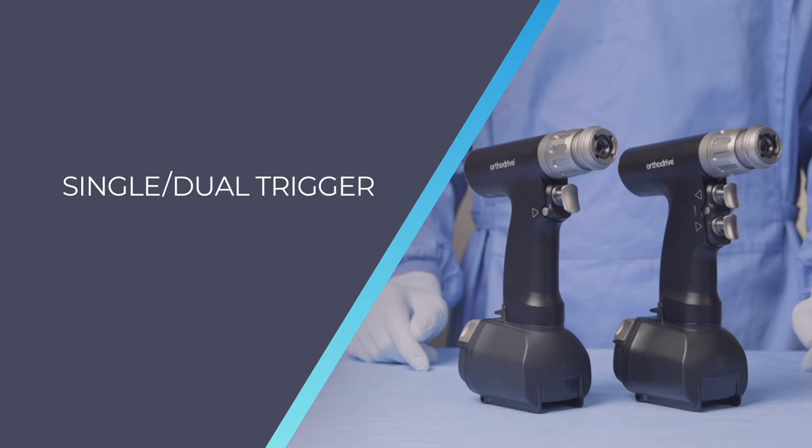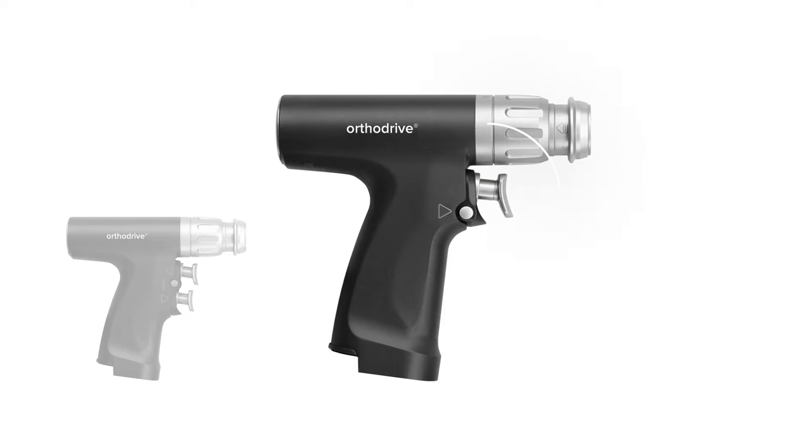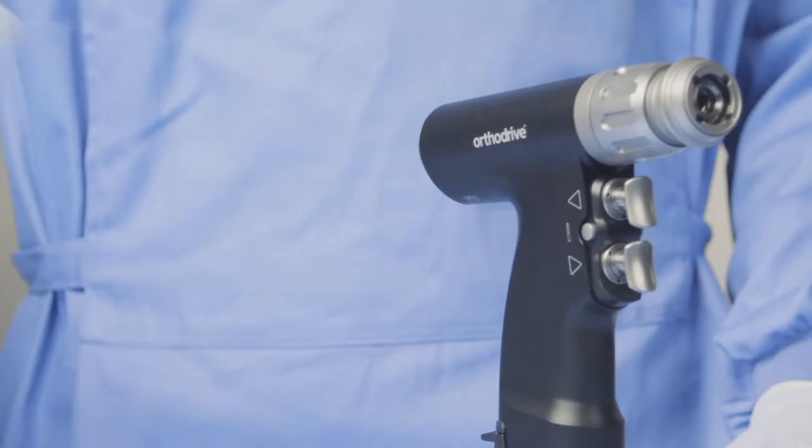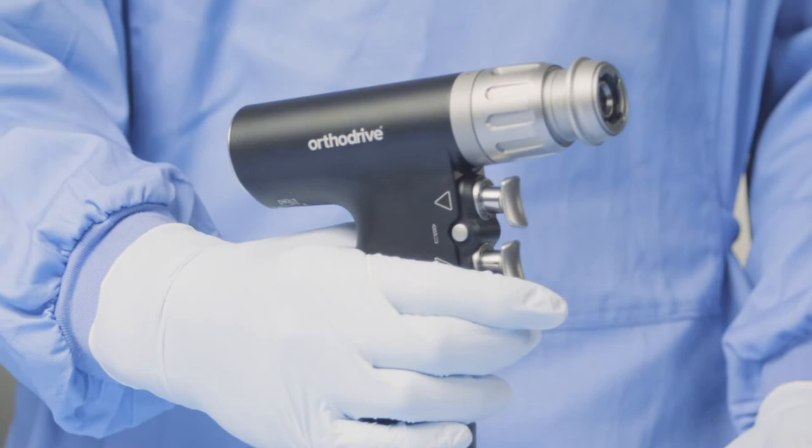This handpiece comes in two options, the single trigger or the dual trigger. For the purpose of this video, we'll focus on the dual trigger. Here, you have two triggers. The bottom trigger runs the tool in a forward motion, whereas the top trigger runs the tool in a reverse motion.